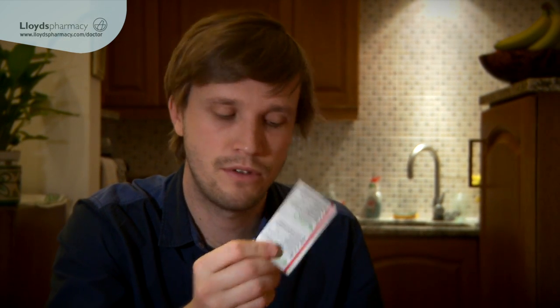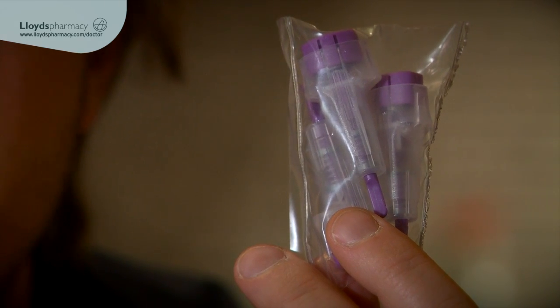Inside this little package we've got some alcoholic strips, non-alcoholic moist wipes, a label for the collection bottle, and these are the lancets that are going to pierce my finger. As you can see you've got three goes at it.